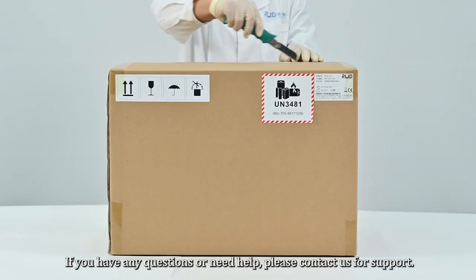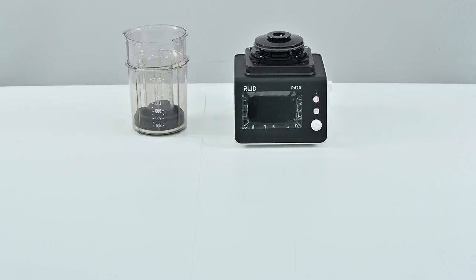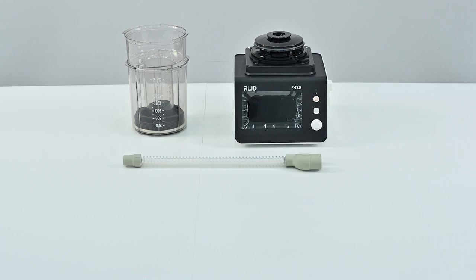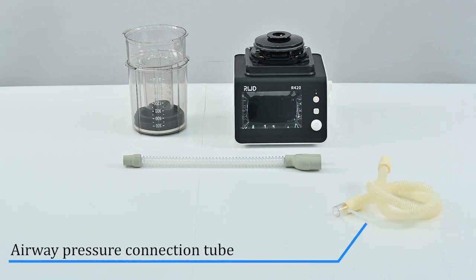If you have any questions or need help, please contact us for support. The package contents include: mainframe, cover and bellows, Y-shaped connecting pipe, and airway pressure connection.